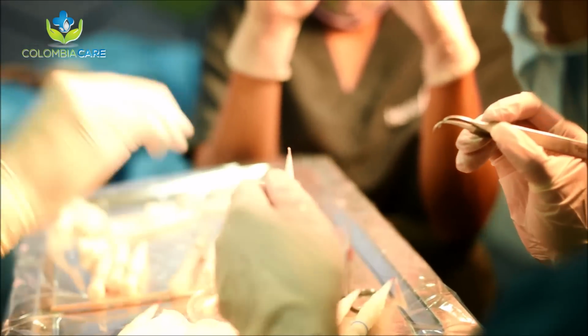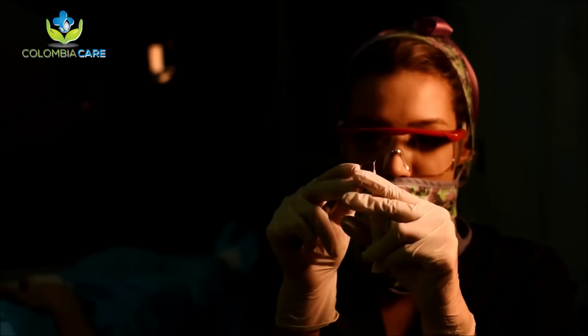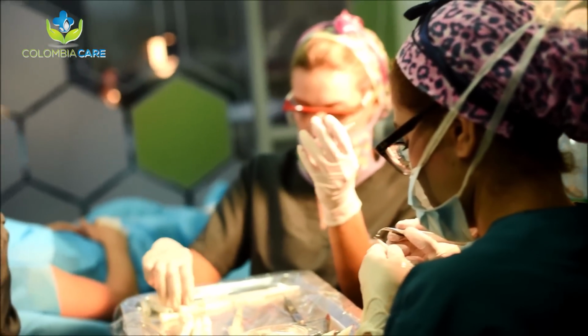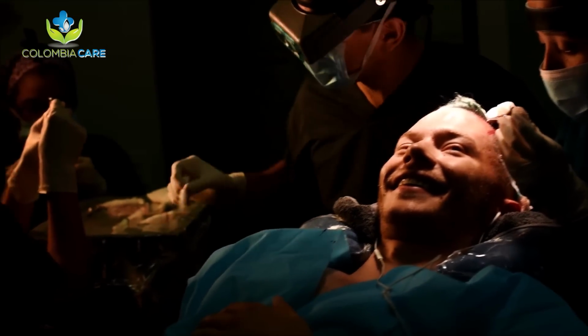In this footage, you can see the assistant applying the follicle on the applicator that is directly transplanted into the one that's placed. The applicators we use are very convenient because they really let us determine the depth and the inclination of each follicle following Dr. Maldonado's instructions.